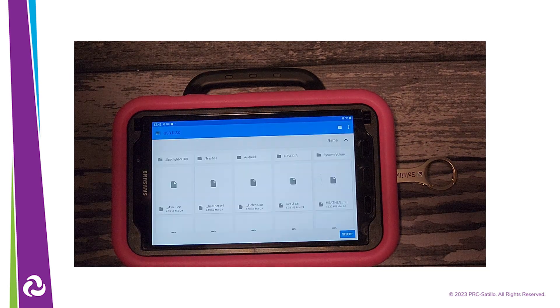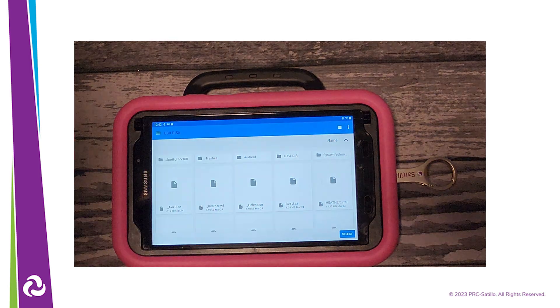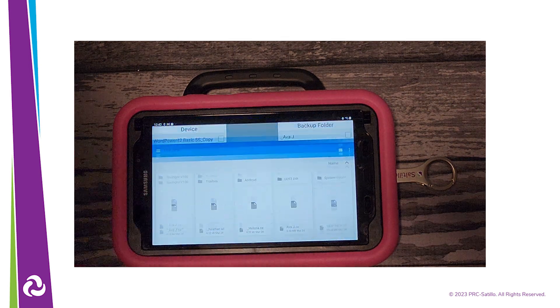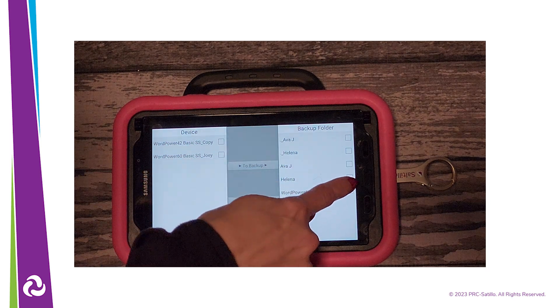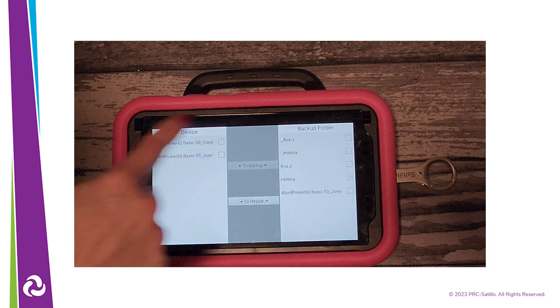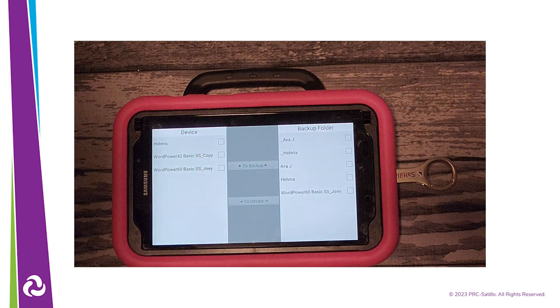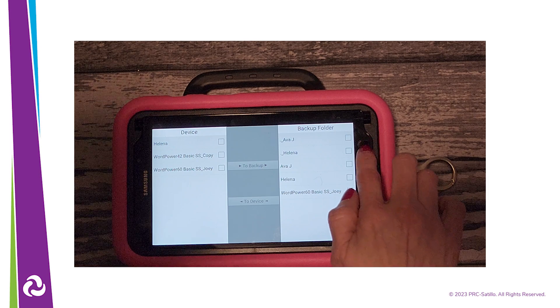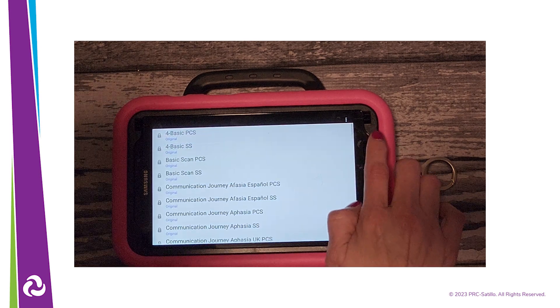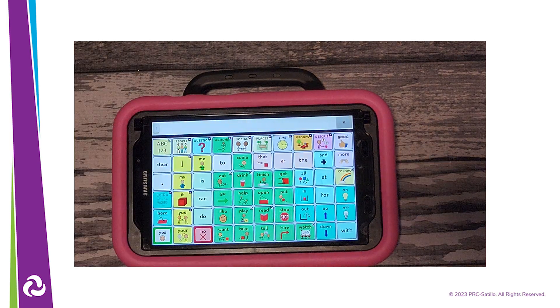Make sure that the USB disk is selected, then tap on the Select button in the lower right corner. Select the file you want to import from the right side of the screen, then tap on the To Device button. The vocabulary file has now transferred to the NovoChat. Press the Go Back button until you are back to your vocabulary file. You can safely remove the dual USB from the NovoChat device.